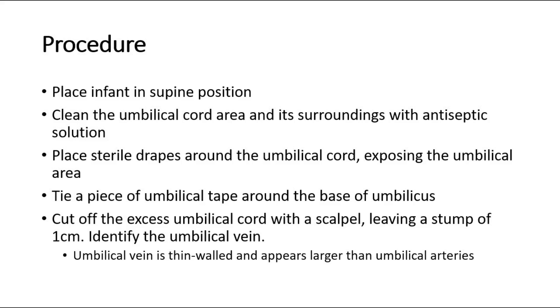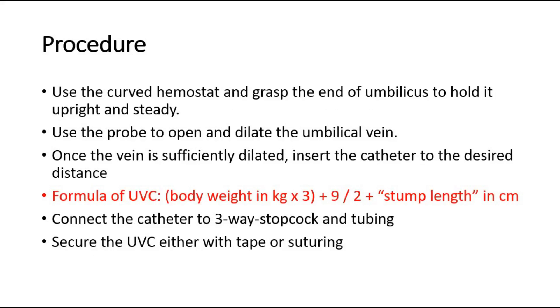We also have to identify the umbilical vein. The umbilical vein is thin-walled and appears larger than the umbilical arteries. Use the curved hemostat and grasp the end of the umbilicus to hold it upright and steady. Use the probe to open and dilate the umbilical vein. Once the vein is sufficiently dilated, insert the catheter to the desired distance. The formula for umbilical vein catheter length is: body weight in kilograms times 3, plus 9, divided by 2, plus stump length in cm.